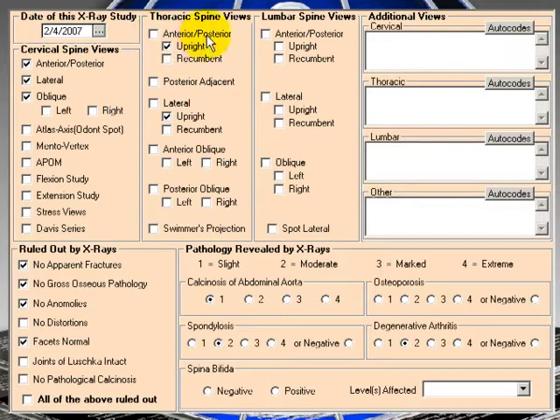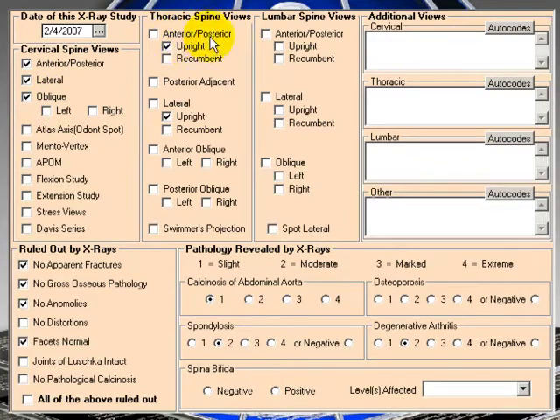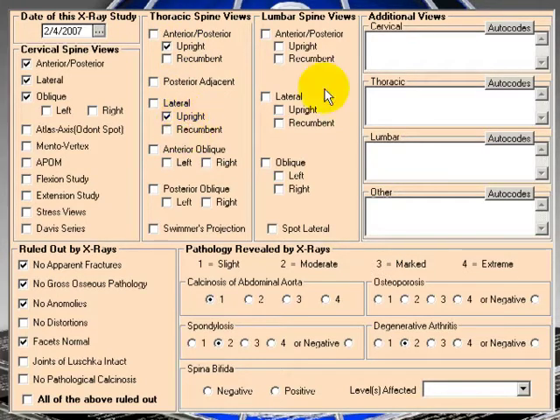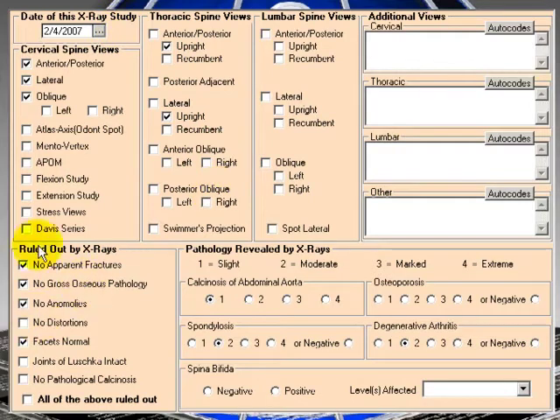For thoracic views, anterior, posterior, upright, lateral, upright. And that's all we have checked off for views.